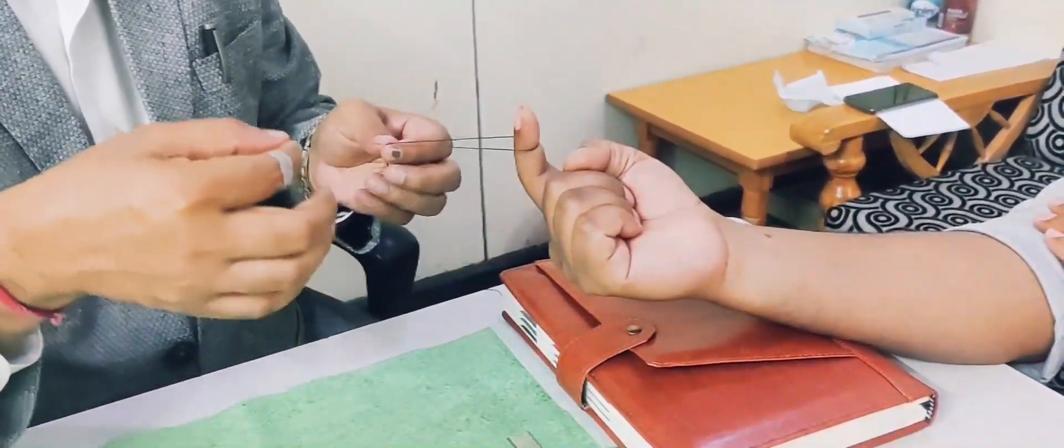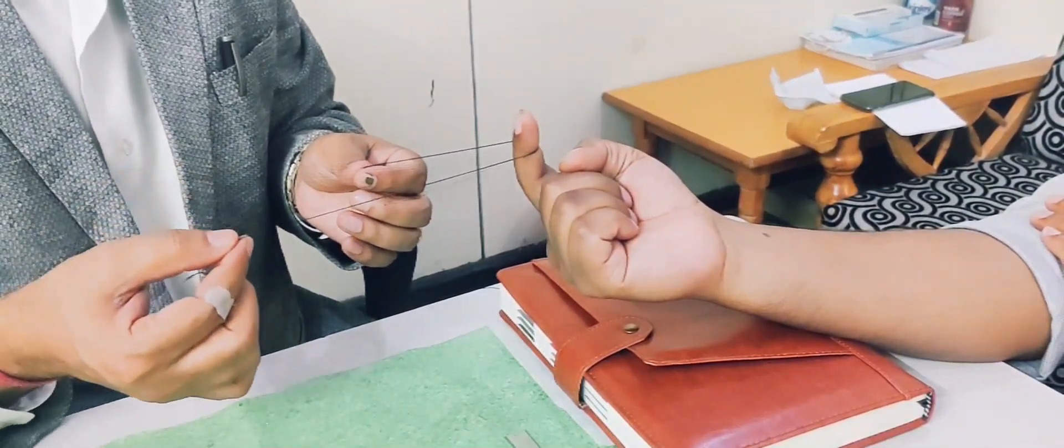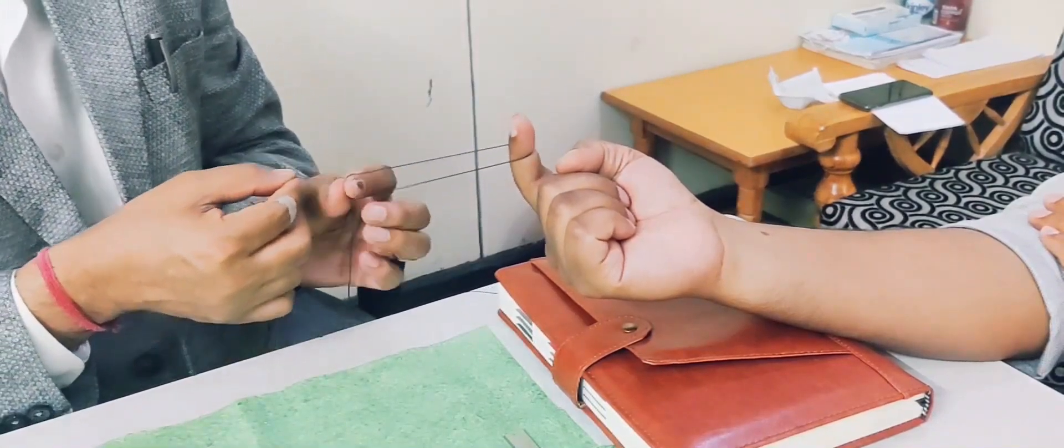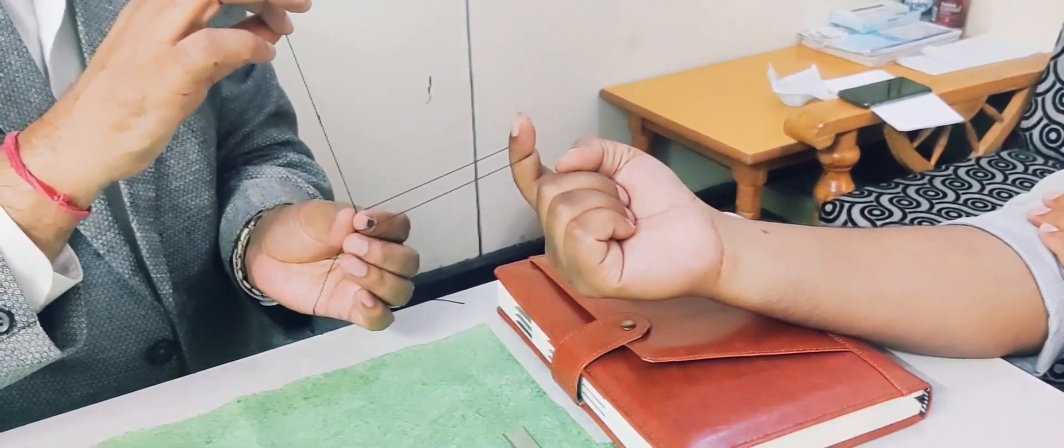So how will we do this? We will see here that we have this silk in my hand. The smaller arm is in my right hand. So we will hold both of these like this, and then we will use this arm to tie this knot.